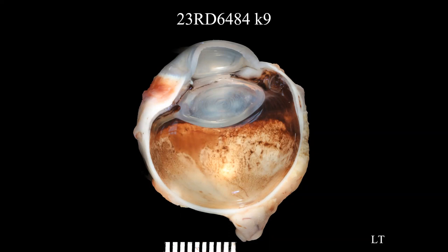Yeah, so this is a cool one. It's a 9-year-old female spayed husky mixed dog with a history of severe panuveitis in the right eye, with secondary glaucoma. The uveitis was not responsive to any treatment. There was a low coccidioides titer detected, so they were suspecting a potentially infectious process. However, they describe a pink fluffy iris nodule in the ventral temporal area, and they were concerned about that. They want to know if that's a granulomatous reaction or something else. Turns out to be something else, but not just one something else, a few something elses. So here's the eye.